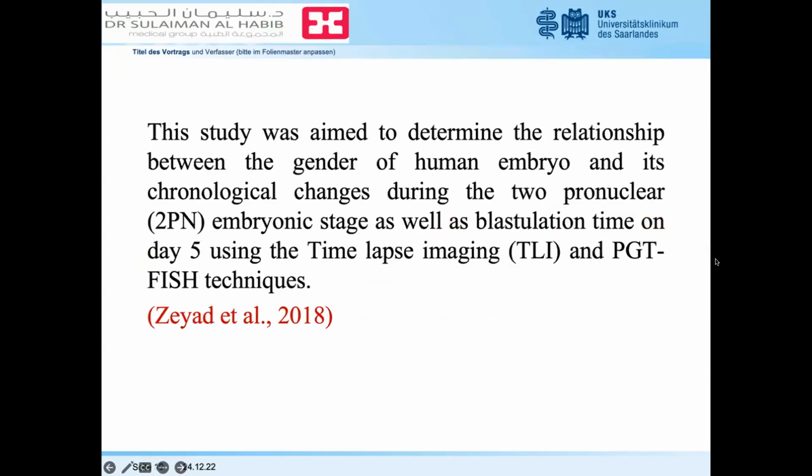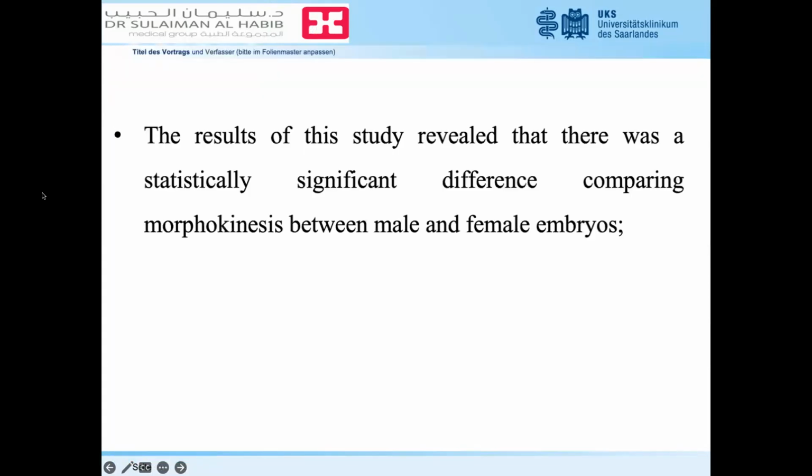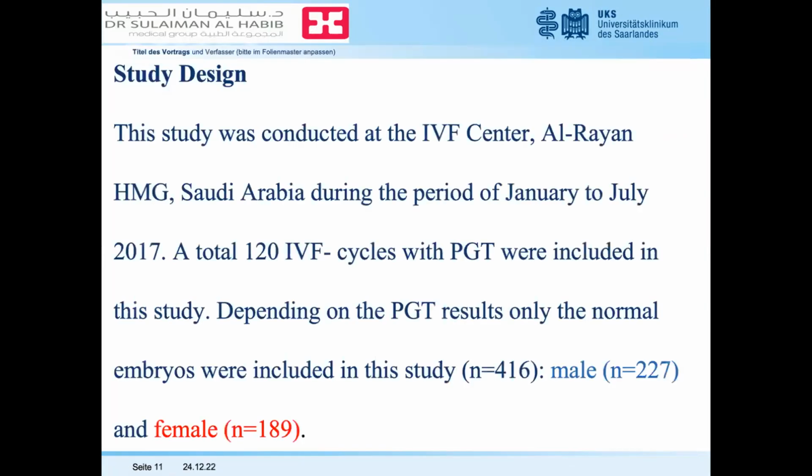This study aimed to determine the relationship between the embryo gender and its chronological changes during the two pronuclear stage, also the embryo division stage, as well as blastulation time on day 5. We used time-lapse imaging and PGT techniques.